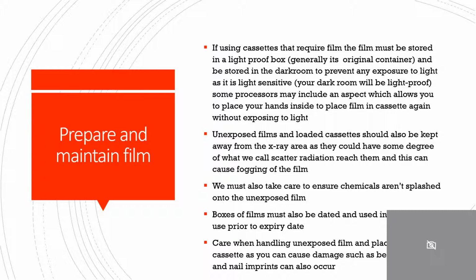Such preparation and maintenance of film is not relevant if you have digital X-ray. However, not all practices do have digital X-ray, or it may be that you work between different branches and may need to encounter different types of X-ray equipment, so this is certainly important for you to be aware of.